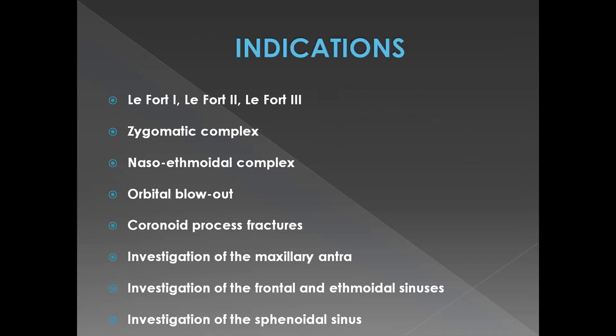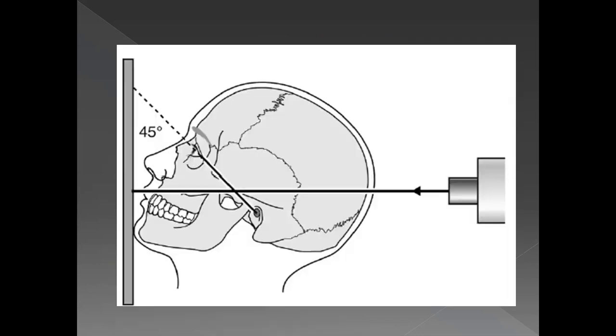So these were the indications. I'll just go through them again quickly. You have all the midface trauma, Le Fort 1, 2, 3, zygomatic complex, NOE fractures, orbital blowout fractures, coronoid fractures, investigation of the maxillary antrum, and investigation of the frontal, ethmoid and sphenoidal sinuses. All right. So these are the gross indications.